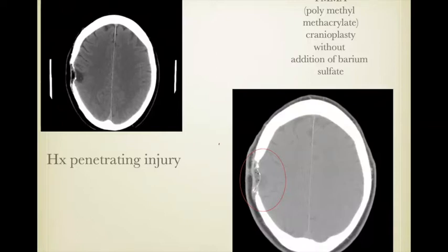That is, the x-rays will go through it quite freely. Remember that this is actually analogous to the plastic used in some windows, so-called plexiglass. So in order to make it visible, there's an additive. It's usually barium sulfate, but if the methacrylate is used without the opacifying agent, it is lucent.